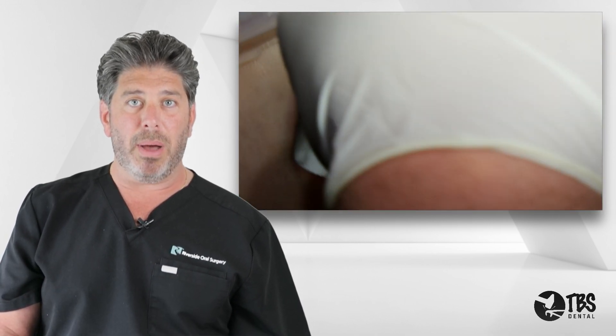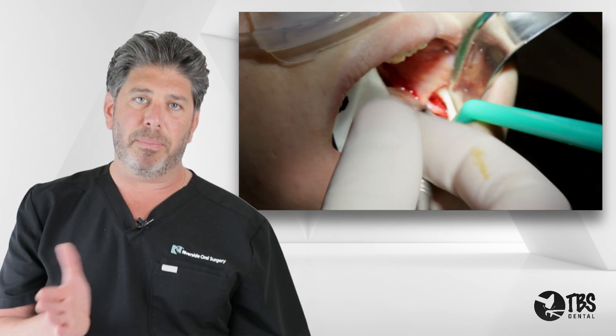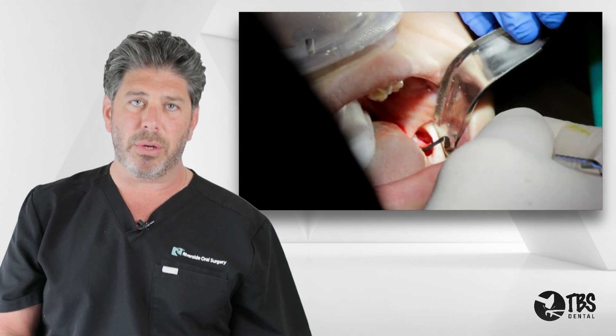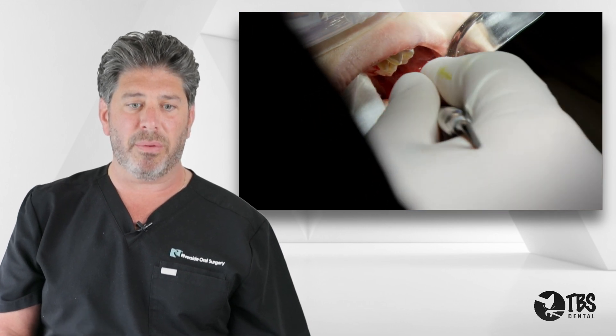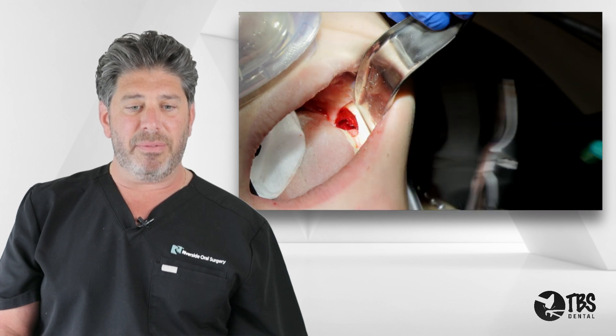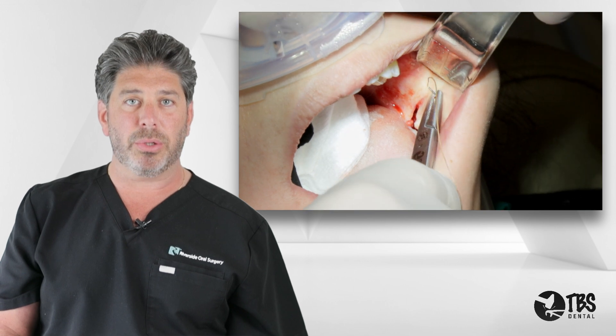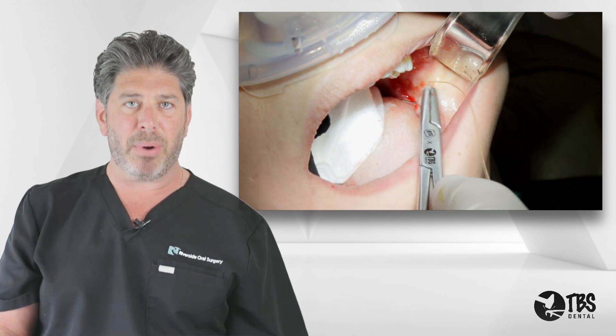In this case there was no bone behind it, so the tooth came out pretty easily and without much trouble. We did have to protect the tissue on the lingual so there's no stretch or damage to the lingual nerve. We remove the rest of the follicle, irrigate very well, and then using two interrupted 3-0 gut sutures, close the flap primarily.